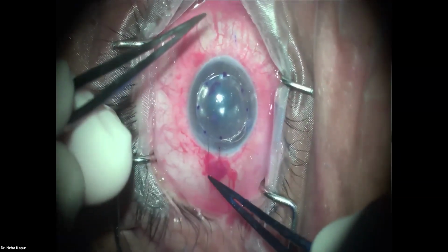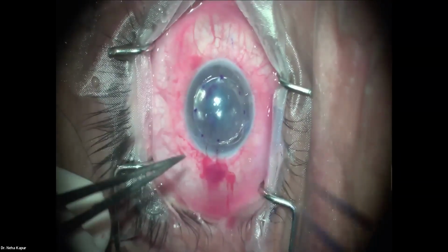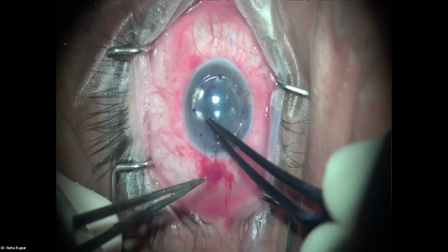Rupali, can you read the question for me? Which microkeratome head or blade holder is used?